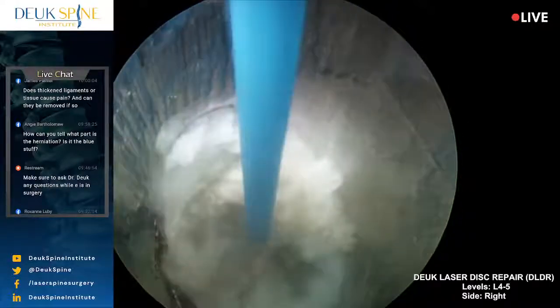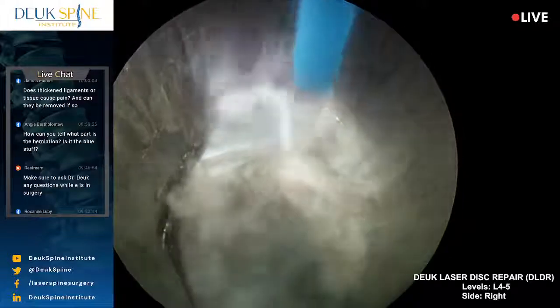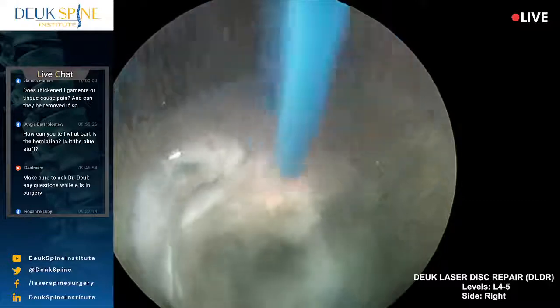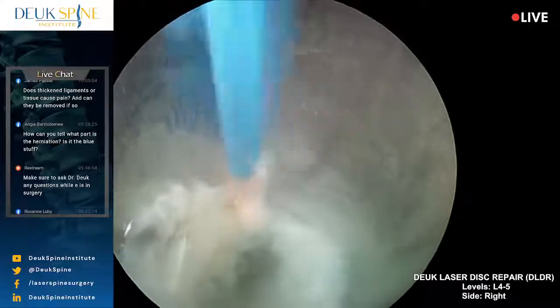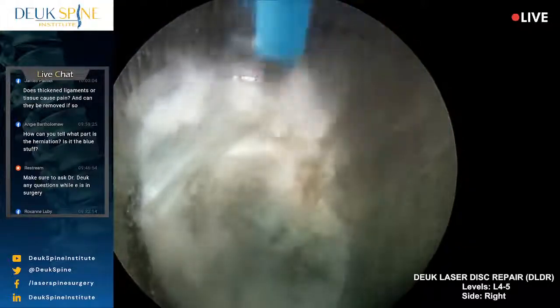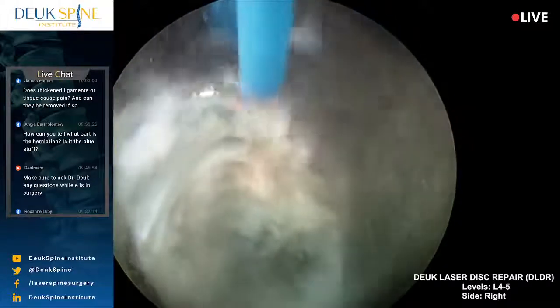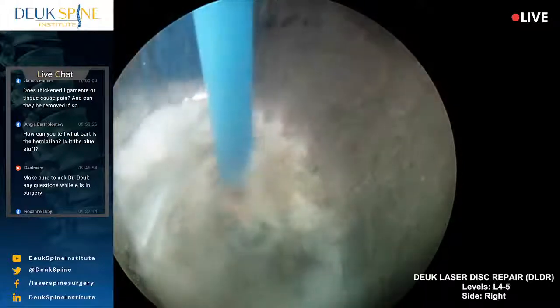All right, just about done here. This is all scarred up. Now, to me, this herniation doesn't look that scarred. It looks like maybe it's more recent. You know what I mean? It's not like some of the ones we've seen together where there's massive amounts of scar tissue because the inflammation's been going on for a long time. This looks like a more recent type of injury.